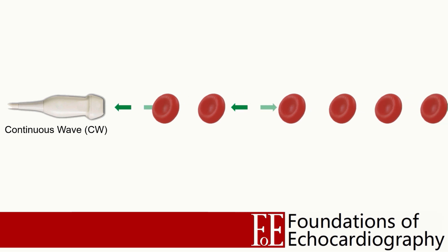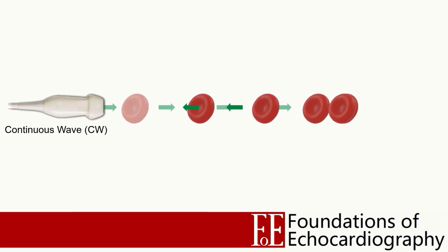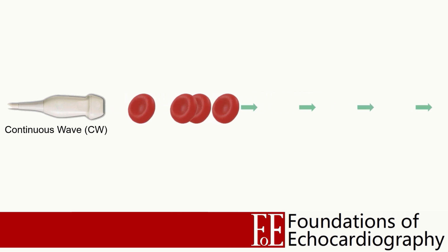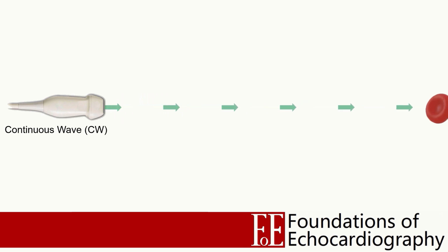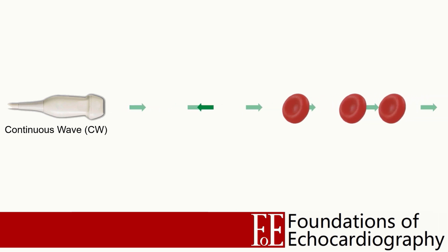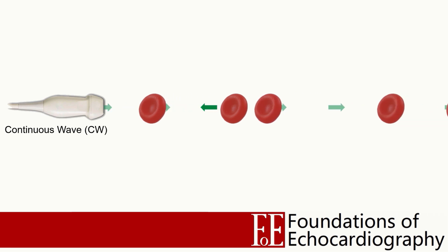When generating a 2D ultrasound image, our crystals vibrate only momentarily, generating the wave that travels into the body, and then they switch to a receiving mode, waiting for the returning reflected sound. The ultrasound machine knows the speed at which the wave is moving through the tissues, and so it can work out where in space the reflective surface is, based on how long it took for the reflection to return.